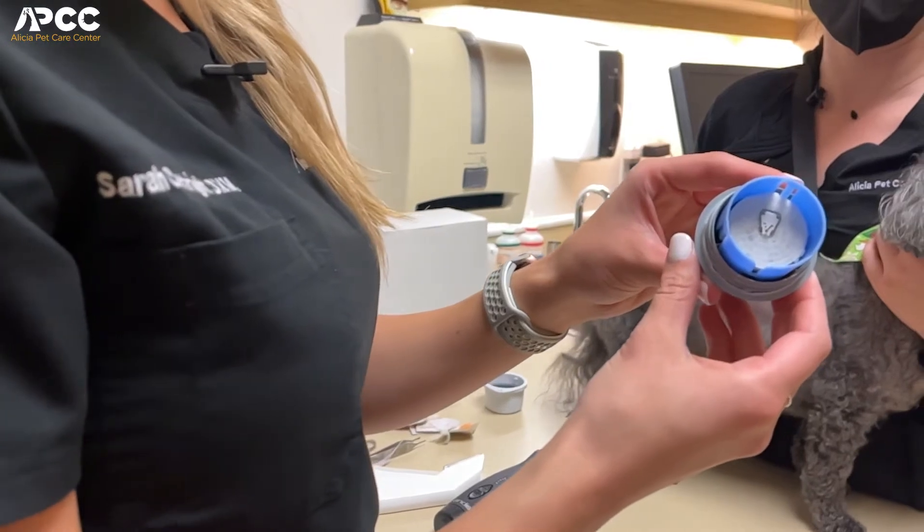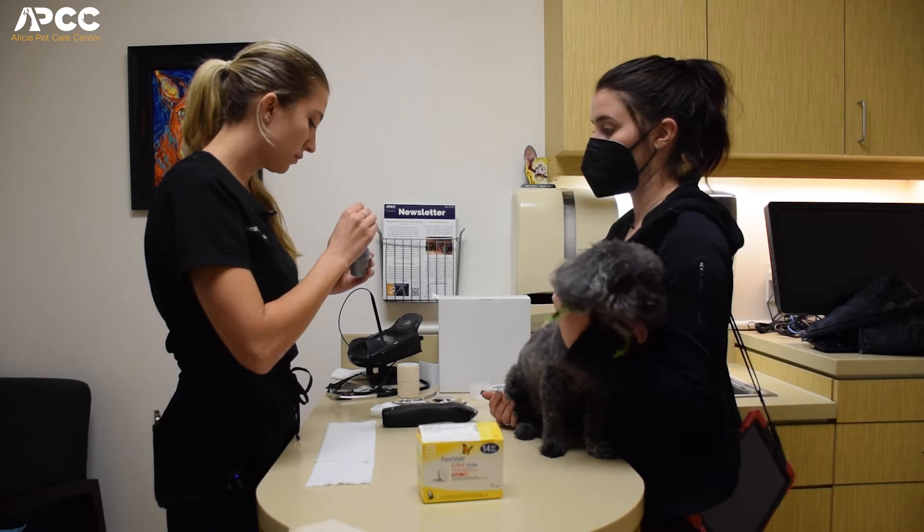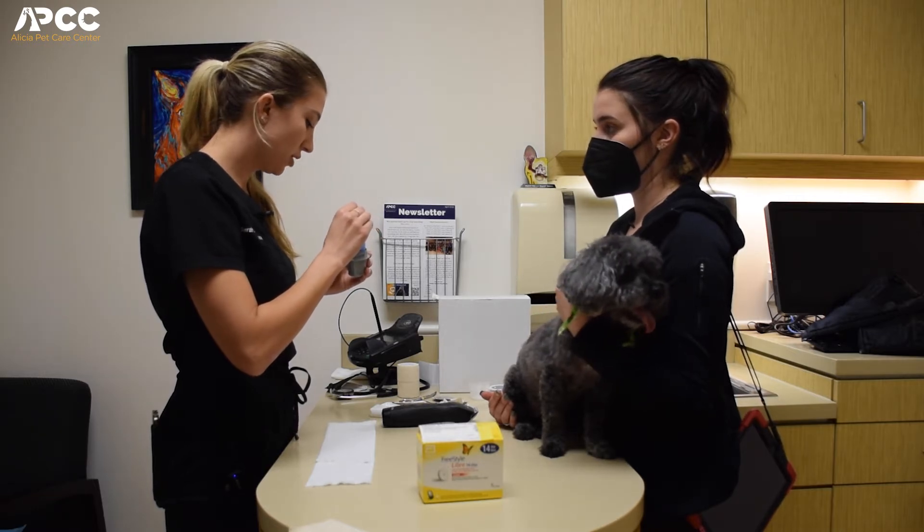This is what the sensor looks like. It's just a very small needle in here. Prior to applying it we are going to put some skin glue on just so it stays on to the patient.